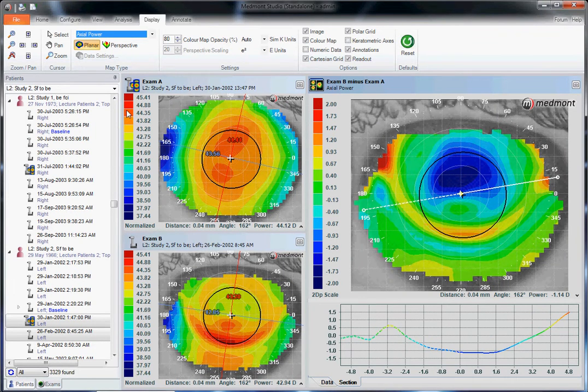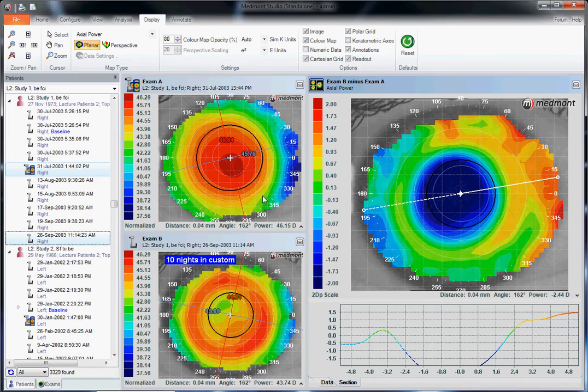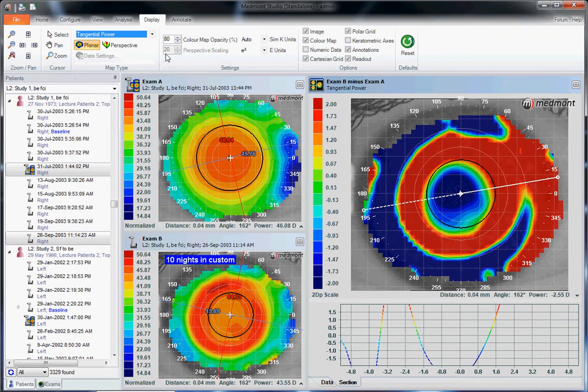So the subtractive map can be used in orthokeratology to understand many things about the treatment. We understand the Rx change on the axial map by clicking our cursor in the center. We can see the position of the treatment zone and the size of the treatment zone. We can switch over to the tangential map and look at the position of the lens in relationship with our pupil with these red and blue rings.